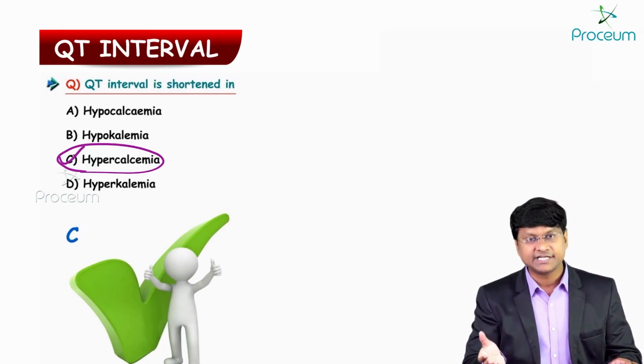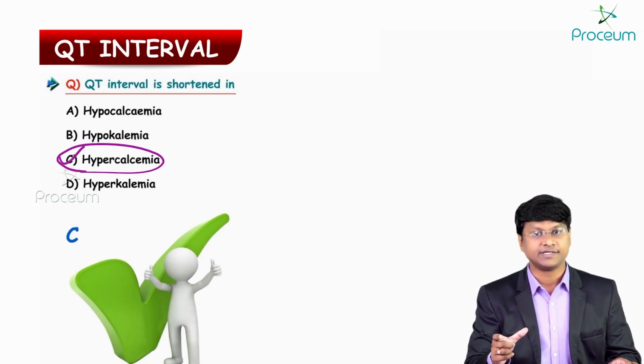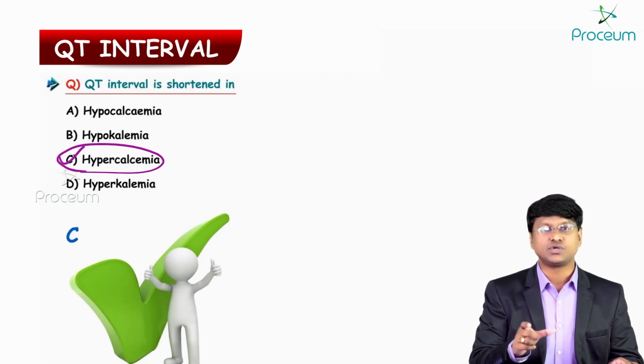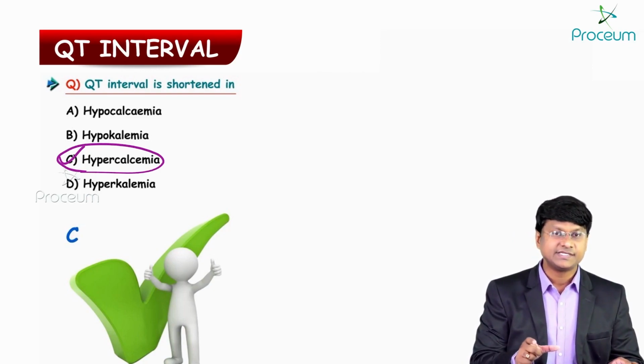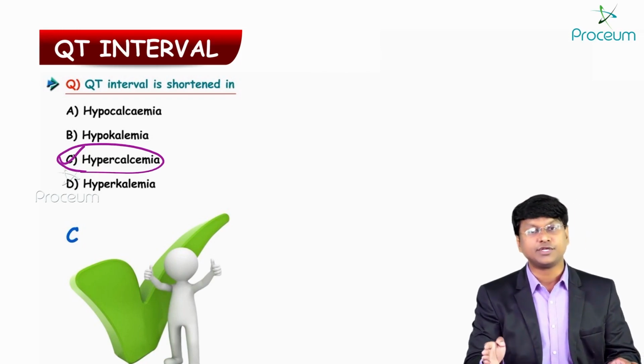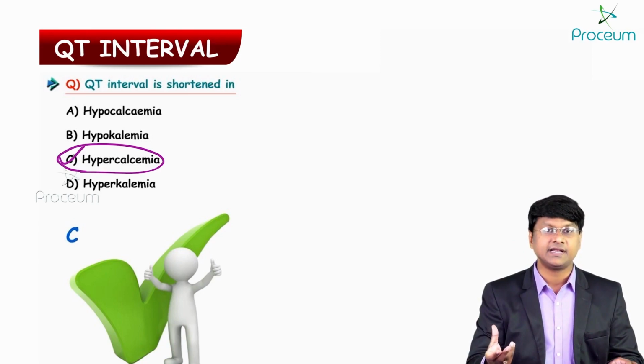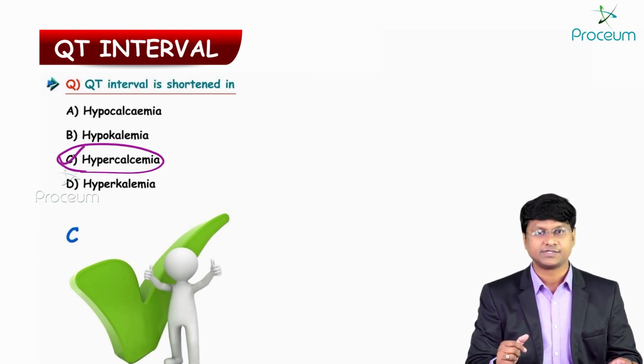And in the next session, I will discuss Torsades de Pointes. As I said, Torsades de Pointes is the precipitation of the prolonged QT interval. So in the next session, we will discuss Torsades de Pointes in detail.